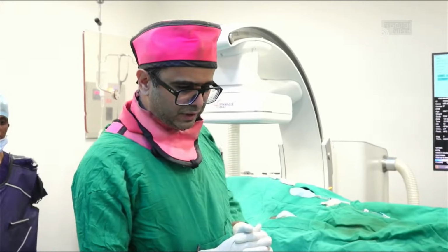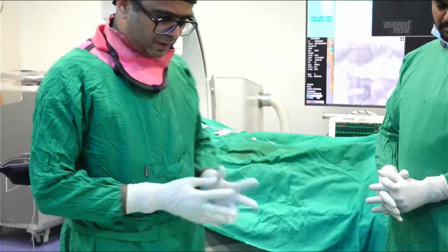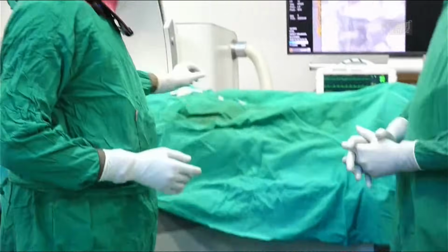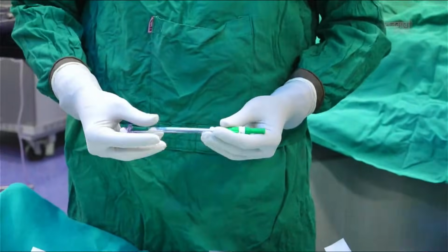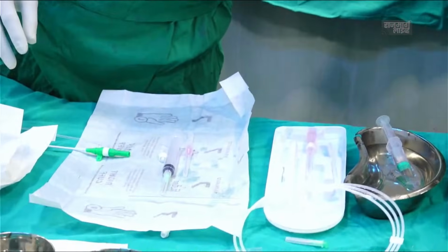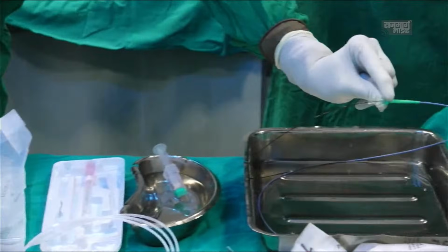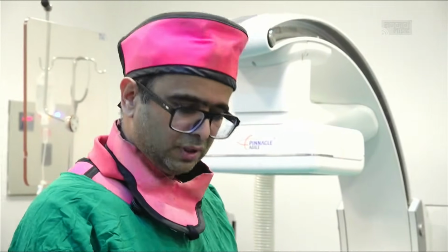The basic procedure of angiography consists of a sheath, which we put in the patient's radial artery or femoral artery, and a catheter. What Dr. Rishikesh said in the morning is a coronary angiography catheter. It is a tube which we take to the coronary artery opening, and there we put the dye and take the radiology shots. So now we will start the procedure one by one.